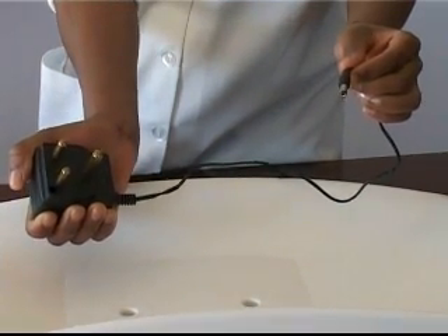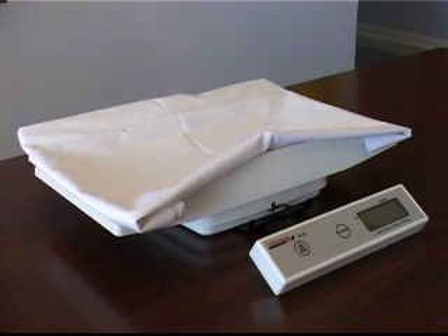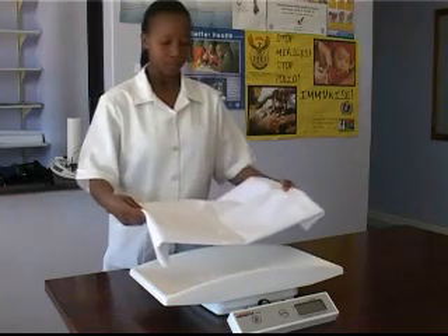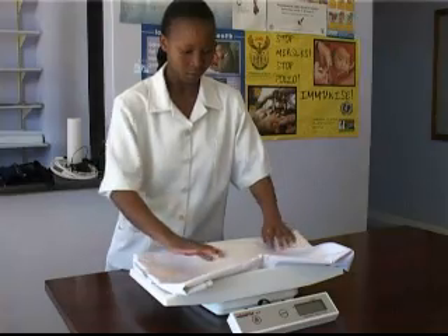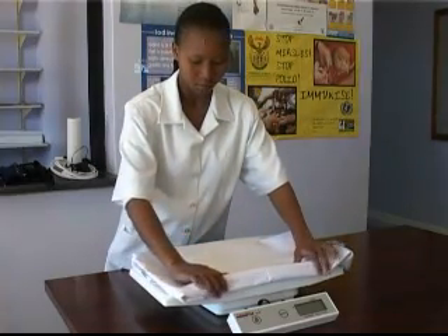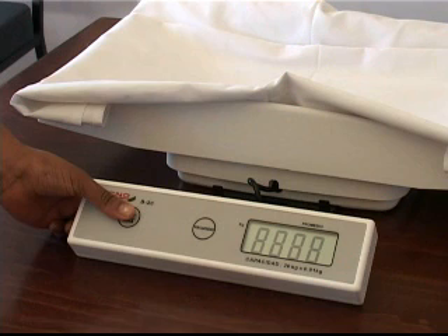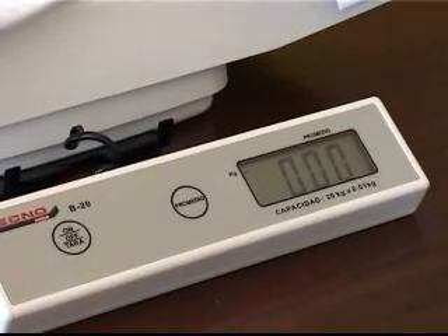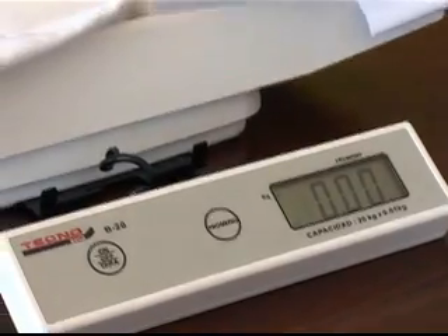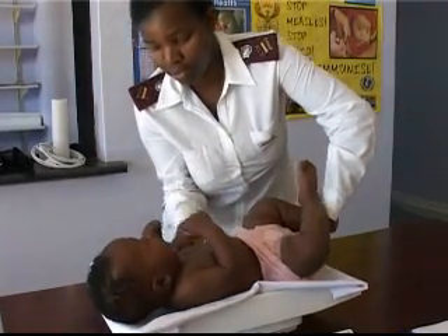Make sure that the scale has a proper power supply, either mains electricity or a battery. Make sure that the scale is positioned on a level surface; it must be steady and not rock to avoid inaccurate readings. Put a blanket in the scale, but take care that the blanket stays inside the scale. The readings will be inaccurate if the blanket touches the base of the scale or the table. With the blanket in place, switch the scale on by pressing the on button. Electronic scales calibrate themselves to a zero reading. At all times, make sure there are no objects near the scale or touching it, as this could cause inaccurate readings. Now gently place the baby into the scale and take the reading.